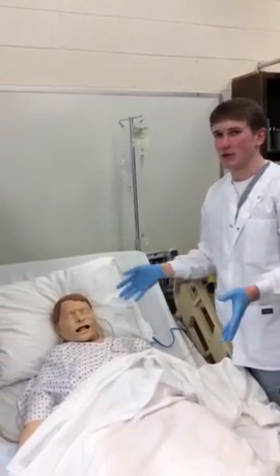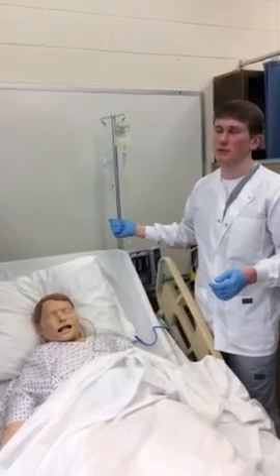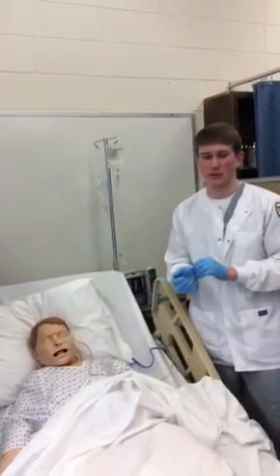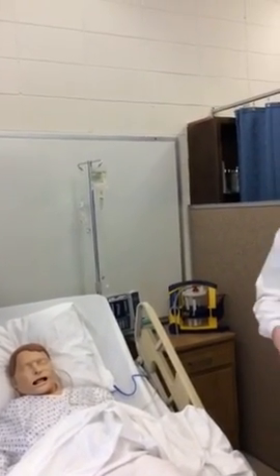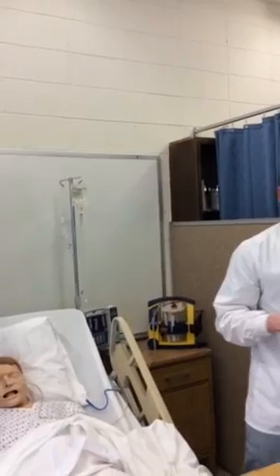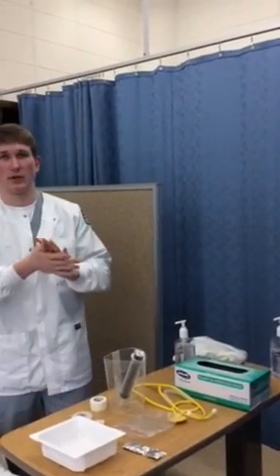And then position the patient back into a position of comfort and lower the bed no more, no less than 30 degrees. Take off my gloves, discard them, perform hand hygiene, and document the procedure.